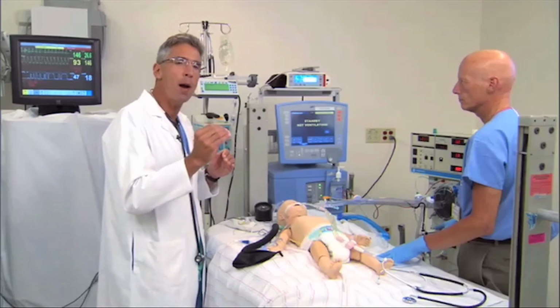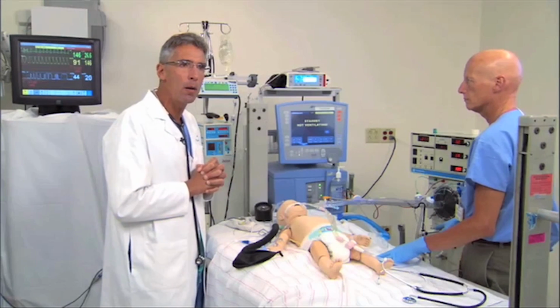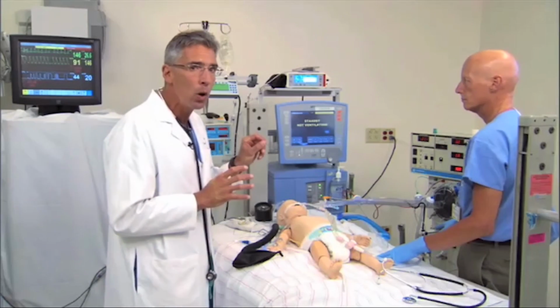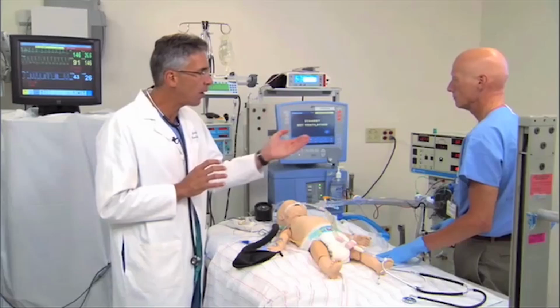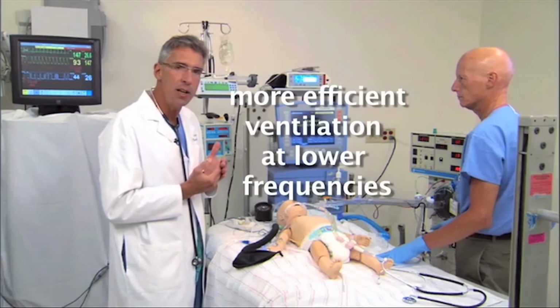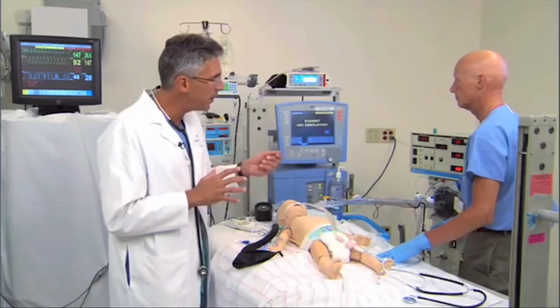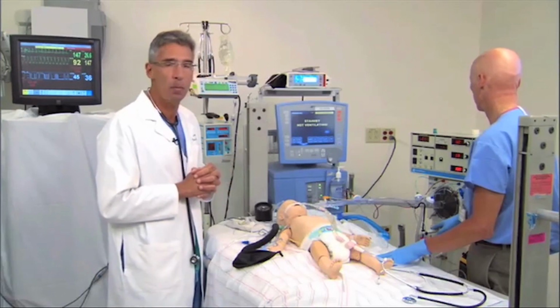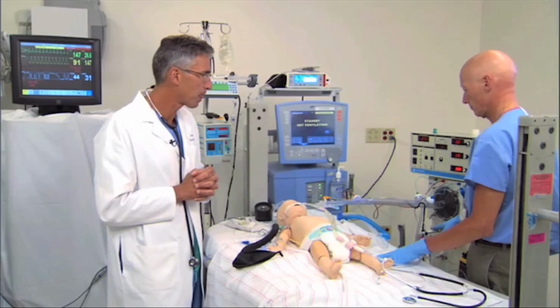If we continue to have hypercapnia on high delta pressure settings, we will occasionally decrease the frequency of the oscillator. This device is much more efficient at alveolar ventilation at lower frequencies. So in order to augment alveolar ventilation, when you've increased delta P dramatically, we will occasionally decrease the frequency.